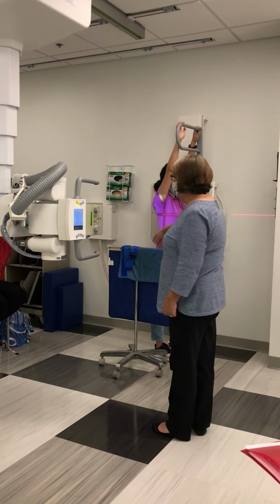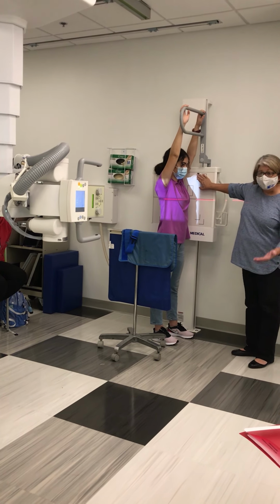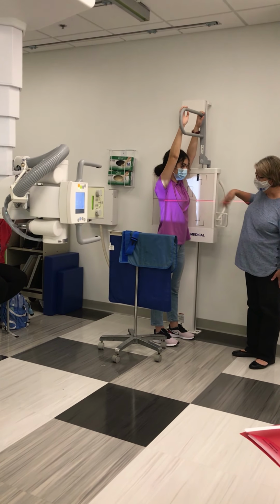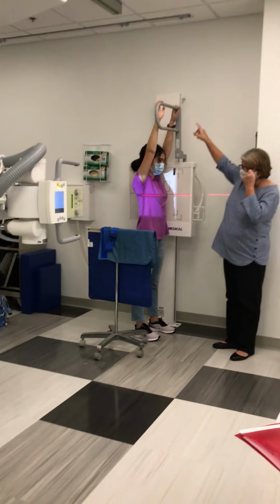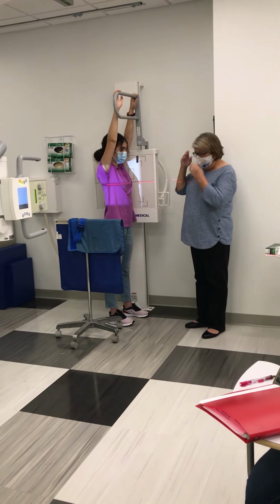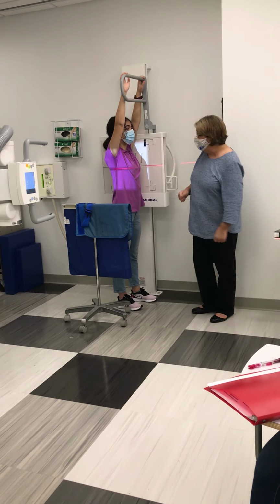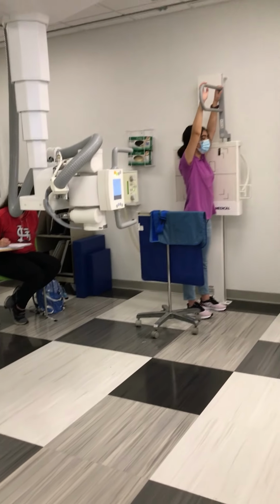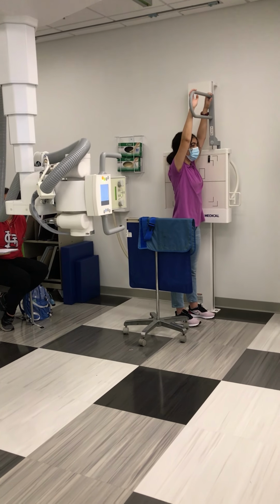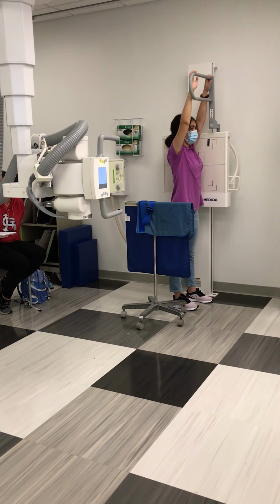I've provided shielding. My marker is placed superiorly. I've used my left marker because the patient's left side is against the bucky. Her arms are reached up to the highest bar so that there's no soft tissue of the arms obscuring the apices. I'm going to ask you to raise your chin. And I'm going to give you some breathing instructions. Taking a deep breath, blow it all the way out. Taking another deep breath and hold it, exposure. You may breathe and relax.